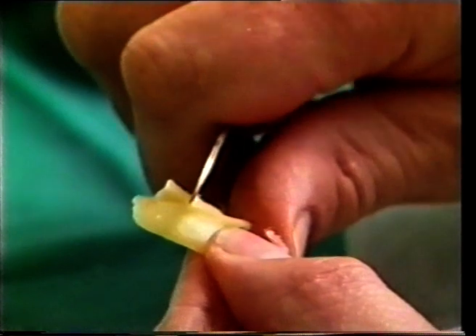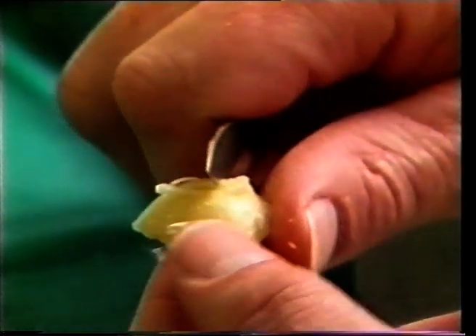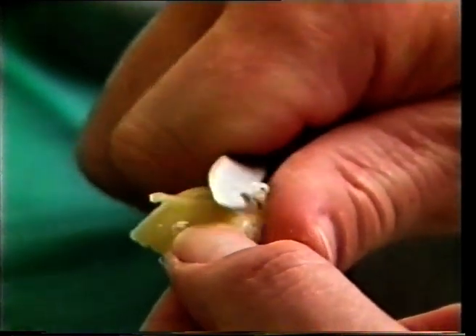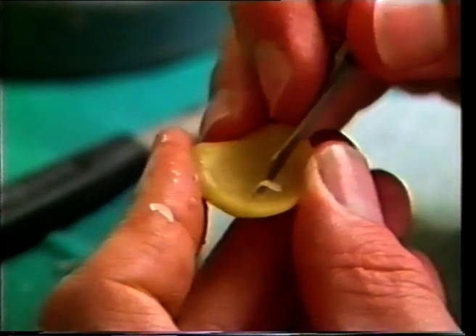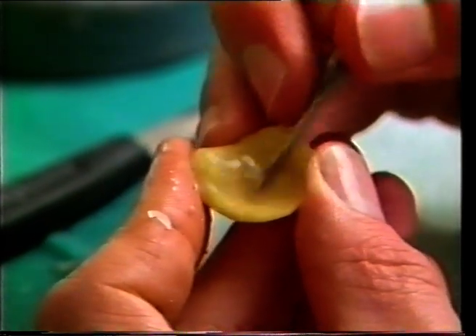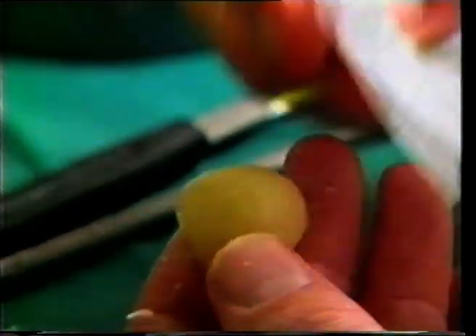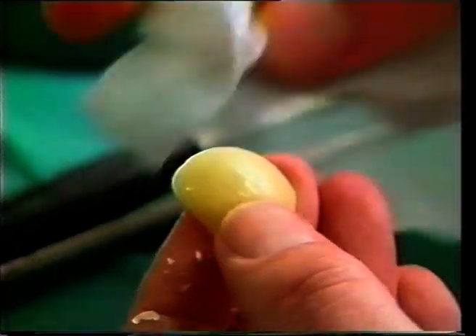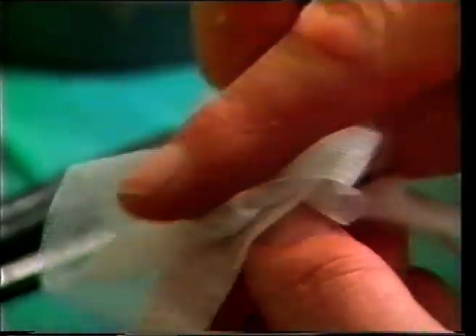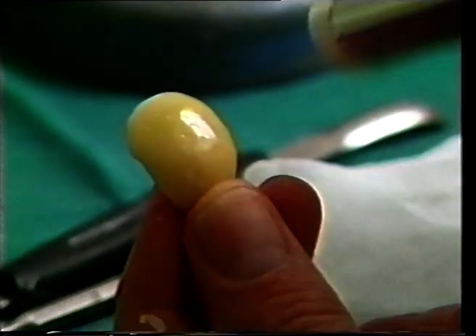Any irregularities are trimmed from the pattern by using a wax knife to carefully remove the excess wax. The pattern is then polished with a gauze cloth, and lightly flamed using the Bunsen burner to achieve a very smooth surface.